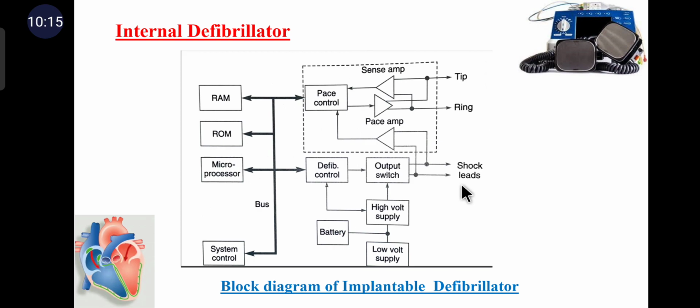Proper sensing of electrical activity in the heart requires precise sensing and discrimination. This is the sense amplifier, and it discriminates the components that comprise the intracardiac signal to differentiate tachycardia and ventricular fibrillation. The sense amplifier must also be immune to both physiological and external sources of interference.